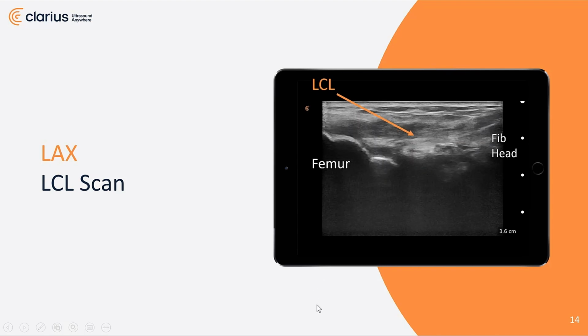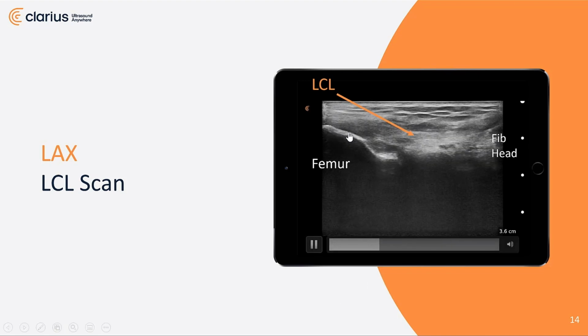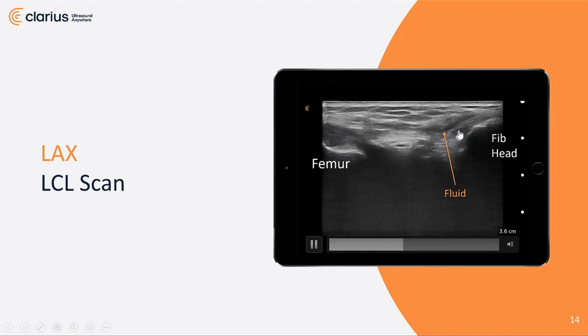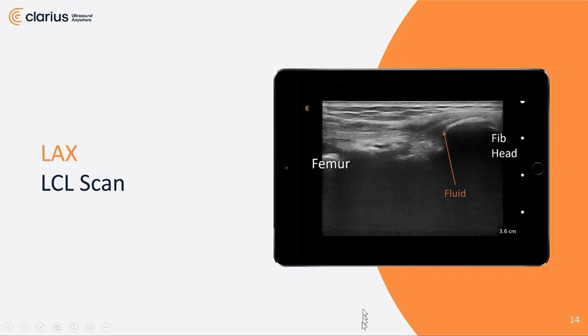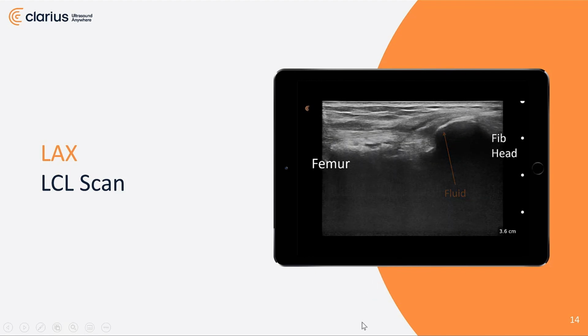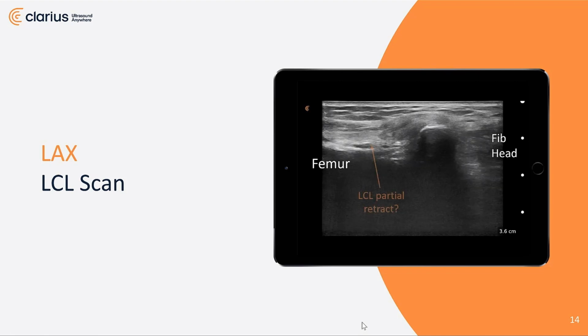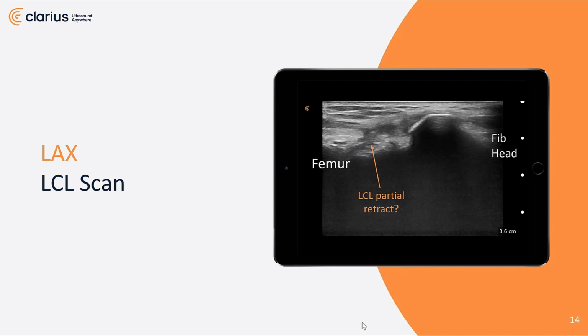As the video plays, you'll see the fibers of the lateral collateral ligament attaching to the lateral condyle. You'll see beginning to develop over the lateral collateral ligament in the distal component some darkness, some area of fluid. You'll also see, as this video winds down, that that fluid corresponds to areas in the fiber of the lateral collateral ligament that have been compromised.